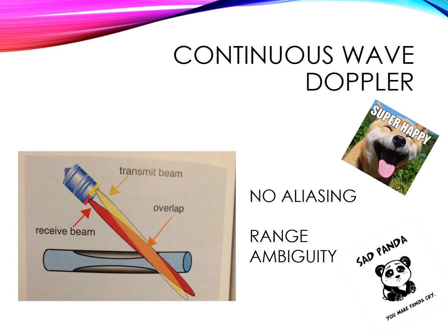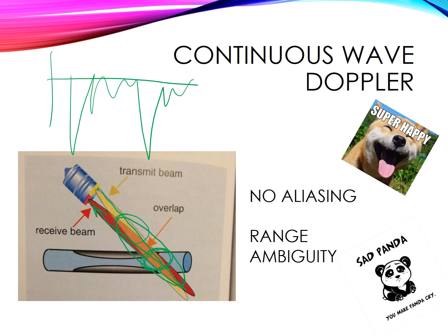So in that last slide I had mentioned that we can't really tell for sure where the continuous wave Doppler is coming back from, and what it actually comes back from, we have the transmitting beam going into the body, and as it hits things, it's going to bounce back and hit the receive crystal. The only spot that we're going to get information from then is anywhere along the line that the transmit beam and the receive beam overlap one another. As these are displayed on our spectral tracing then, we're going to get varying velocities as things overlap in that area.